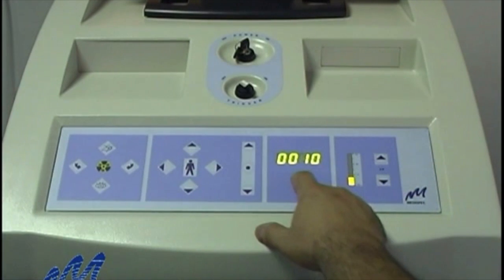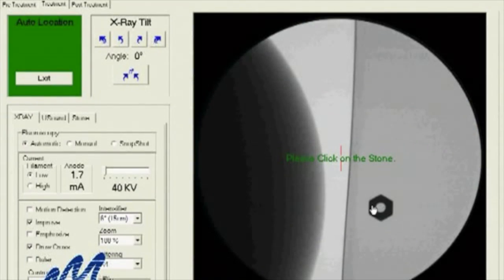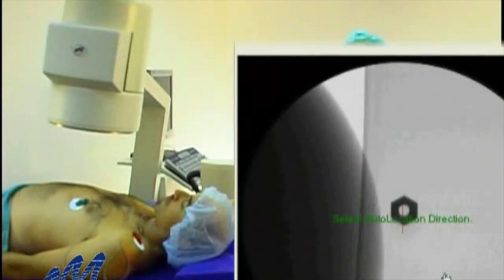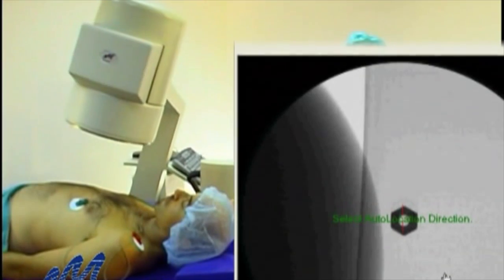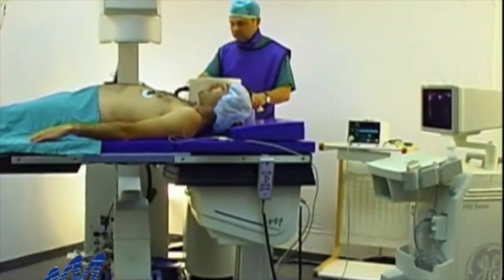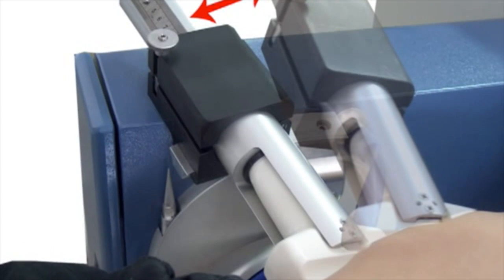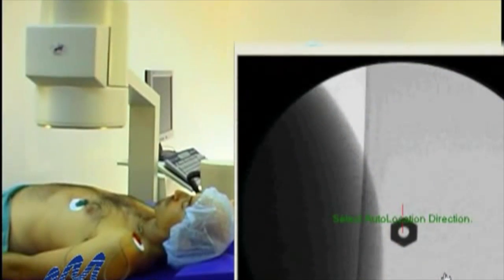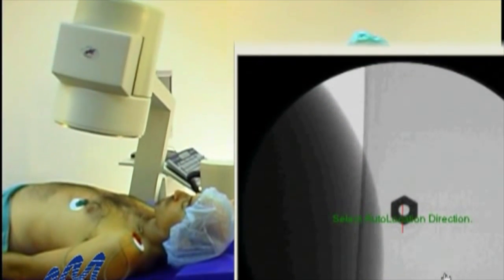The E3000 can be used with MediSpec's innovative VisionSpec x-ray system or with most high-quality systems on the market, featuring advanced image processing and data storage. It can also be integrated with an optional ultrasound localization unit, enabling real-time imaging and stone targeting during treatment.